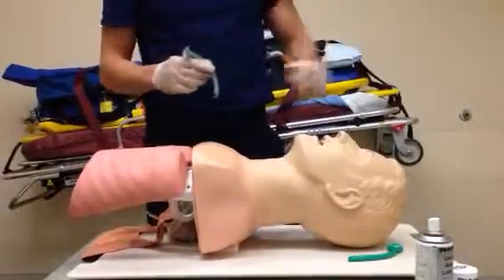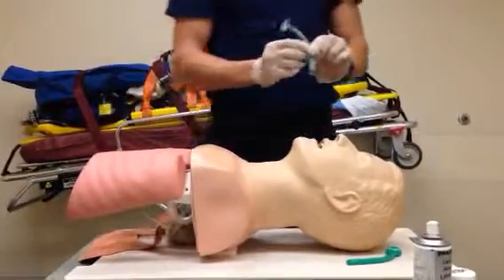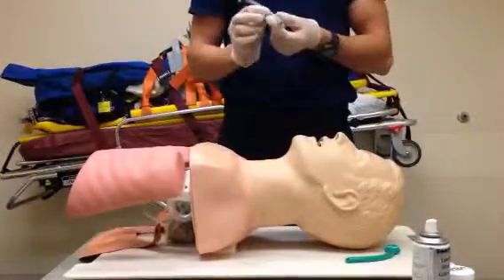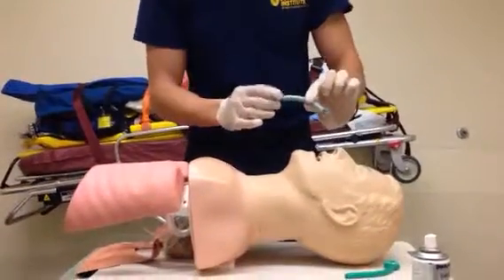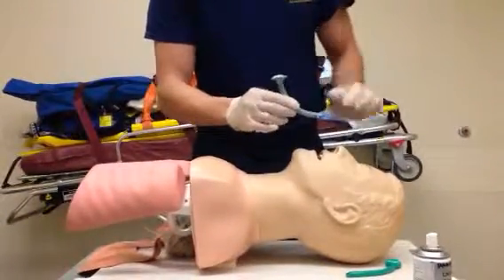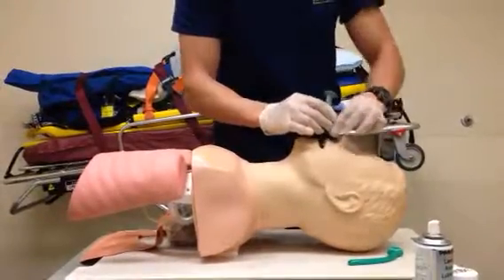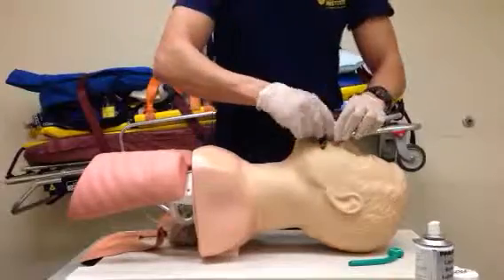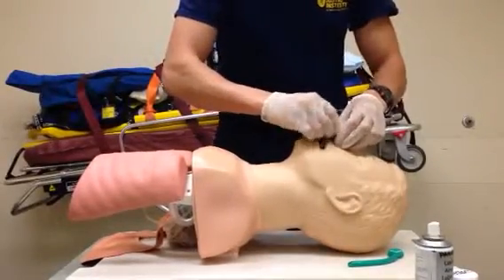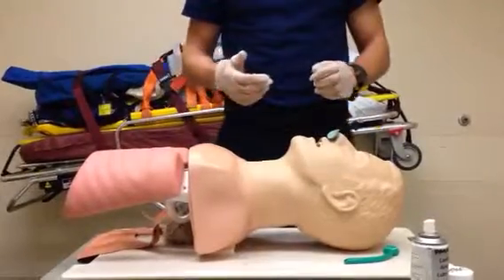You generally want to go for the right nares first, as it tends to be larger than the left one. Whichever nostril you're going for, ensure that the bevel is away from the septum. If going right, it faces this way; for the left, you alter your technique by rotating it in the opposite direction. You're inserting it and halfway twist it over the normal curvature like that.